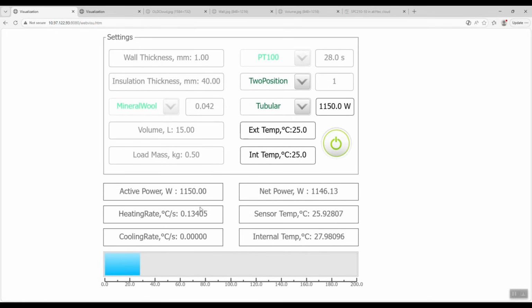The second value is the current heating rate, which decreases over time. More precisely, it decreases according to the laws of the physical thermal balance model that we implemented, taking into account the settings we specified. The third value is the current cooling rate, which is 0 during the heating phase. The fourth value is the net power or thermal balance, meaning the current active power minus heat losses. The fifth value is the temperature sensor reading inside the sterilizer chamber.